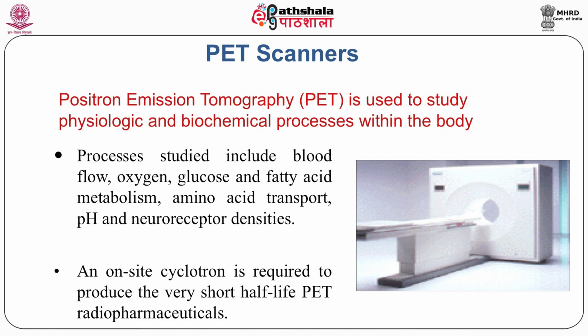So we can say that PET is used to study physiological and biochemical function within the body. Processes studied include blood flow, oxygen, glucose and fatty acid metabolism, amino acids, transport, pH and neuroreceptor densities.